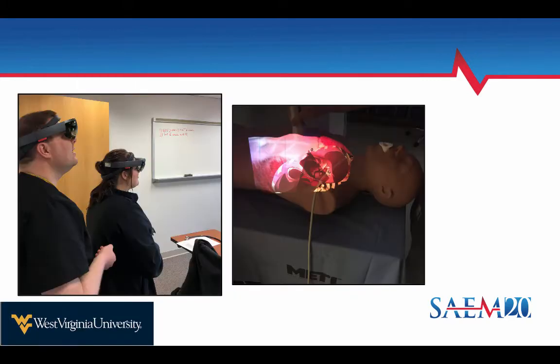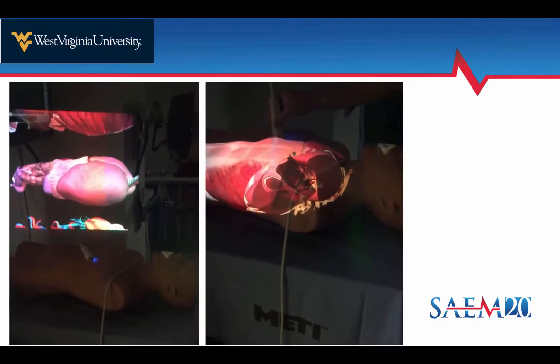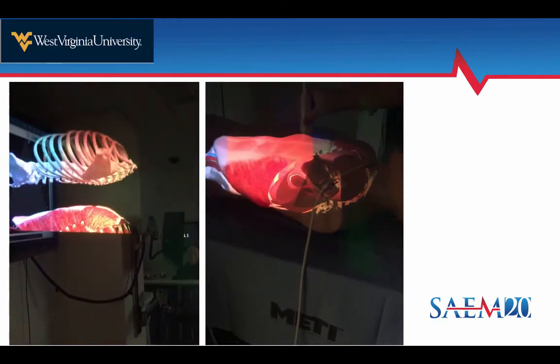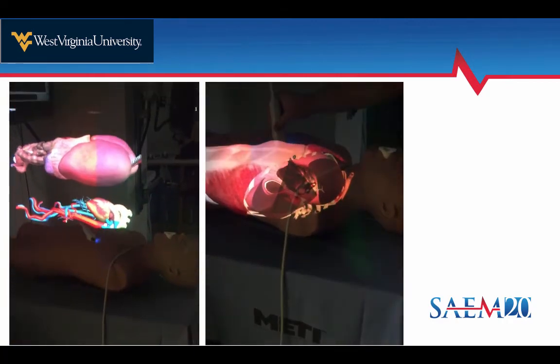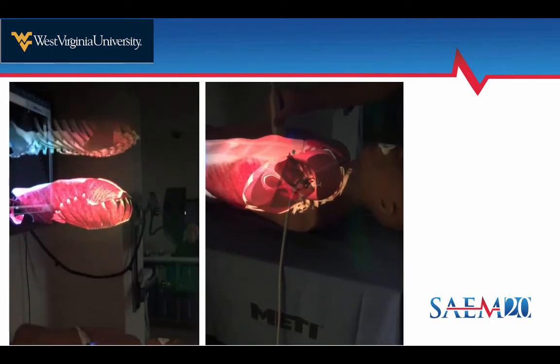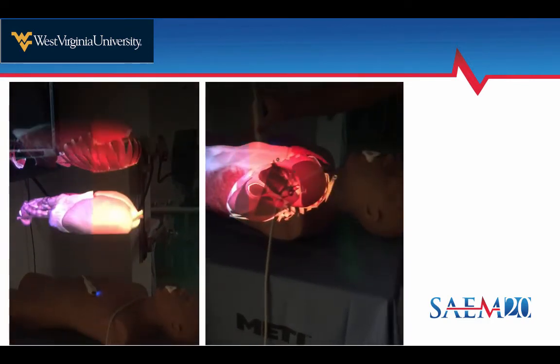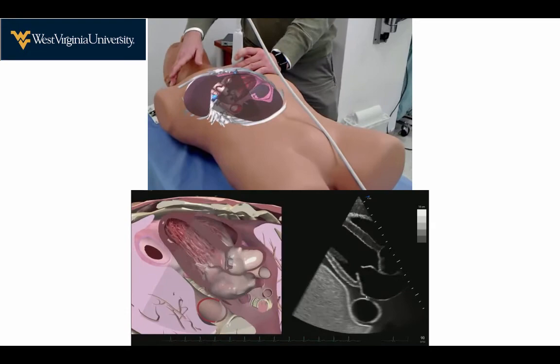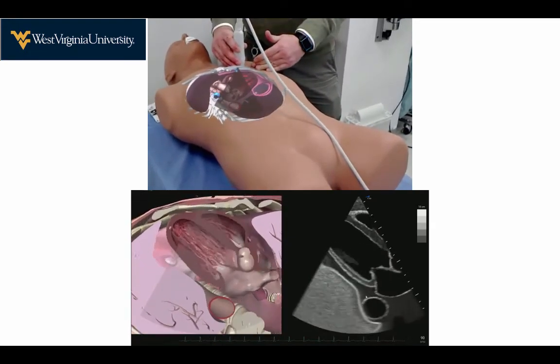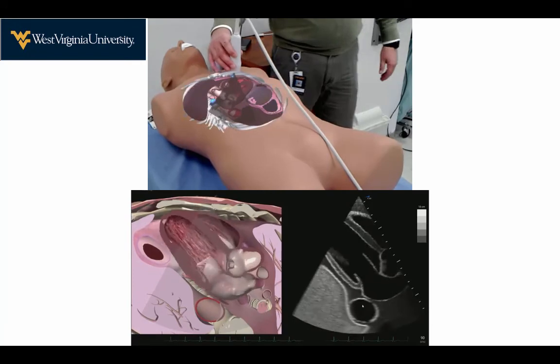Here's some of our faculty at West Virginia University, and it's important to recognize that these are the goggles that you wear with this particular product, and the image that is portrayed in these slides here is the actual image that is seen through the goggles. So you can layer out different body structures, however, still recognizing that your surroundings are still your surroundings in this augmented reality. Here's some more images from some of the products that we use at West Virginia to educate our medical students and our nursing students.